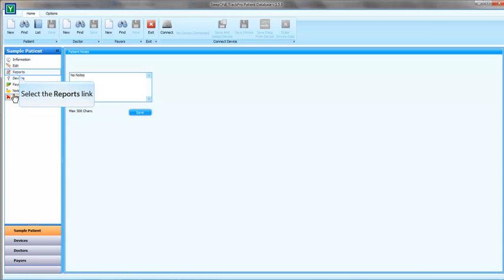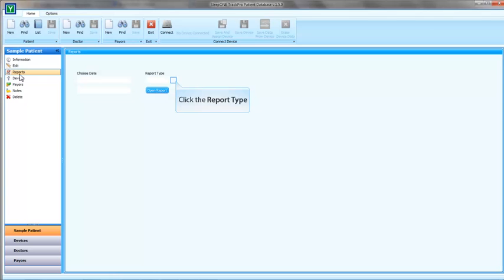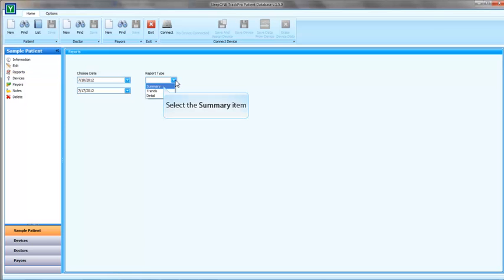Now let's examine the reporting part of the software. In the Reporting tab, there are certain information software needs to give you a patient report. First one is the dates for the report. When you click on the date selection, dates with data is written in bold. Second one is the report type. Let's select the summary type.